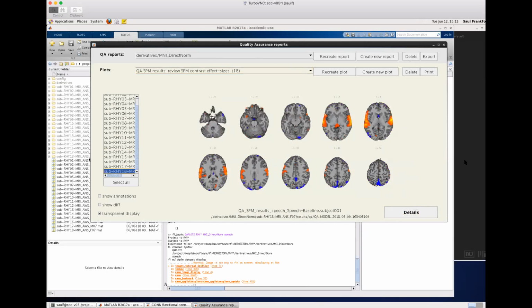There is one way to just add additional scans: have ART mark a user-defined list of scans as outliers by default. So perhaps I can make it simpler in this case, because right now the way that I think Sol is modeling the invalid scans is just as an additional condition that we can then look at if we care about it or not.